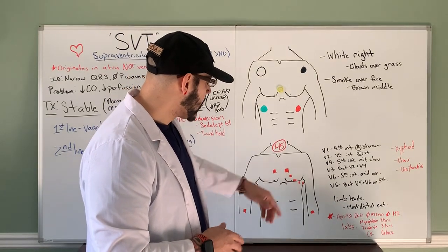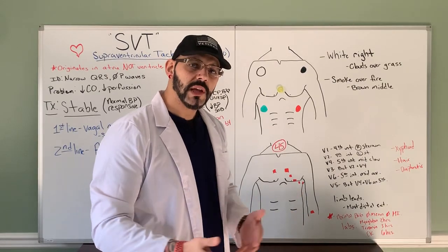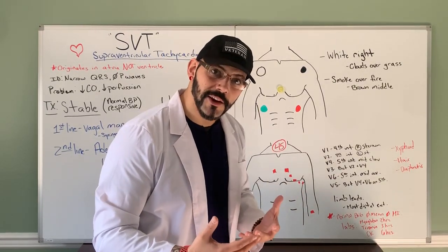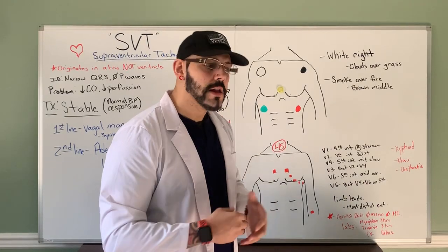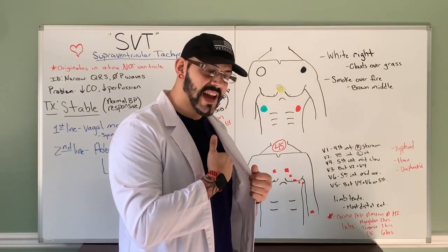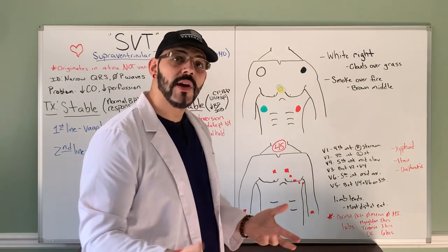Placement of the stickers for the EKG. You may find yourself having a little hiccup if they have excessive hair, or a wool sweater on, kind of thing. If they have a lot of hair, you may have to shave a little bit of it. You may have to really press down to get a good stick on it, all right? And they may be diaphoretic, all right?